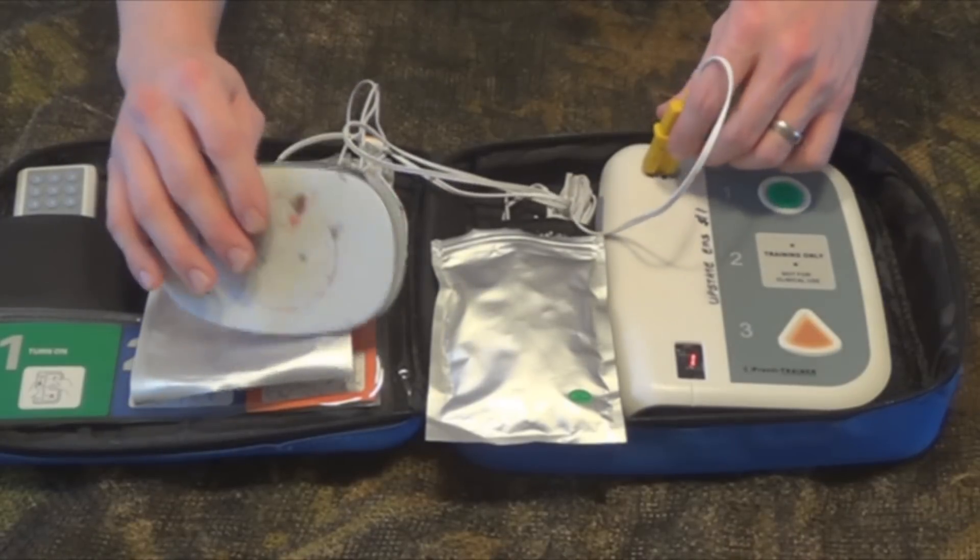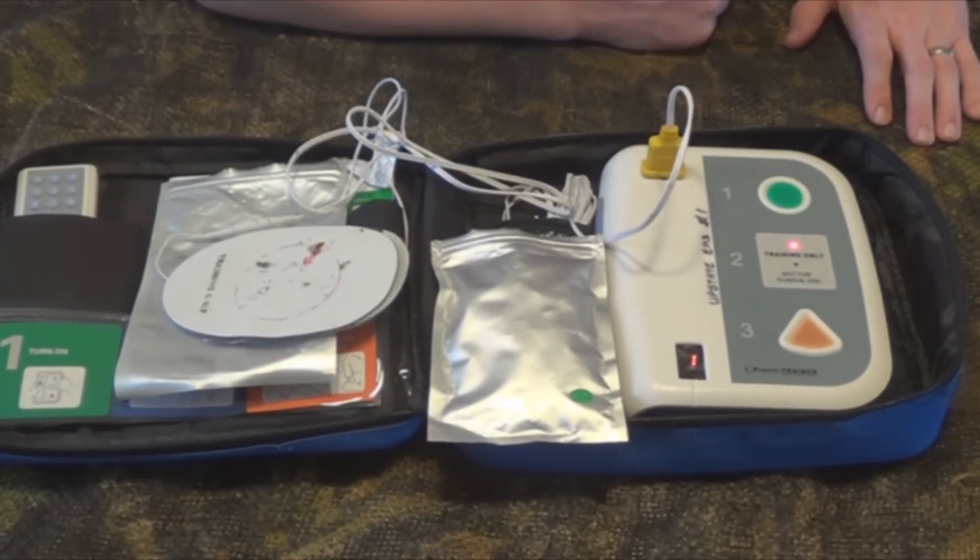Once we have the pads placed, it begins analyzing the heart rhythm. Do not touch the patient while it's doing this.